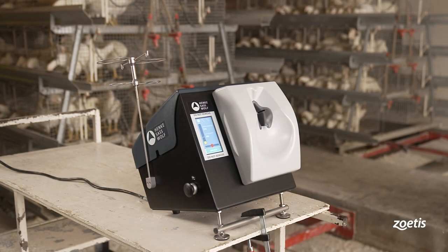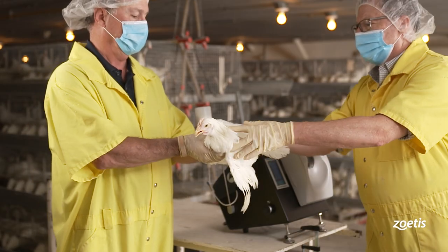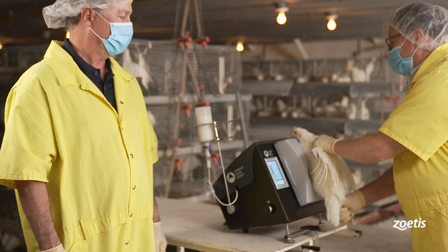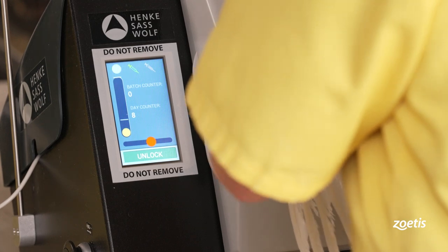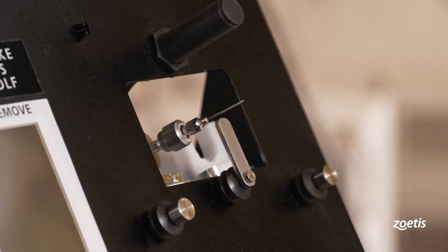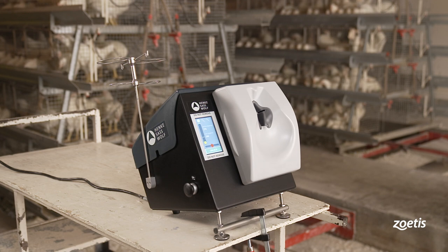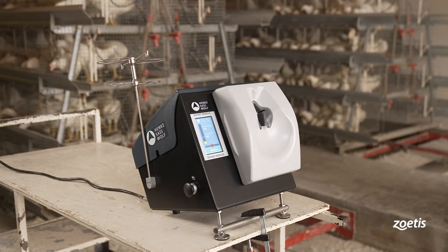In this video we will demonstrate how to use the double breast vaccinator in the field. The video will go over how to set up the vaccine, the on-screen navigation process, and how to vaccinate birds using the double breast vaccinator. The video will also touch on the various warning signals as well as recommendations on the maintenance of the device. For detailed instructions on setup and maintenance, please watch the double breast vaccinator setup, operation, and cleaning video.